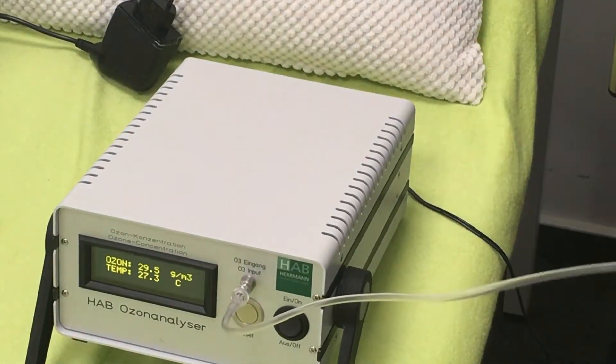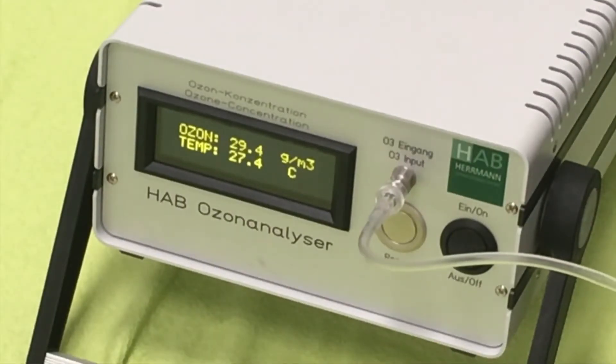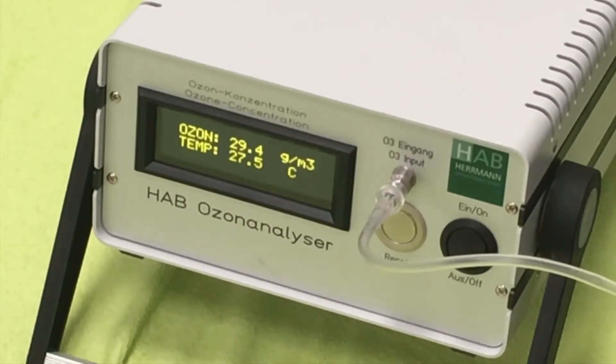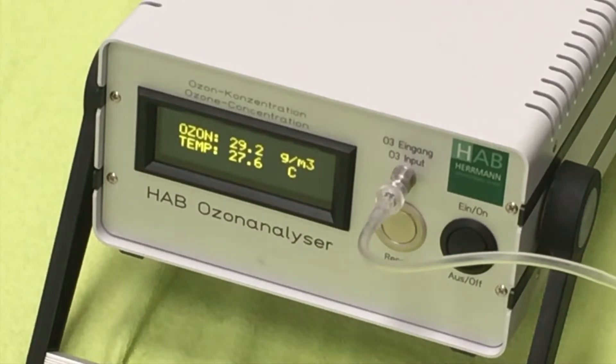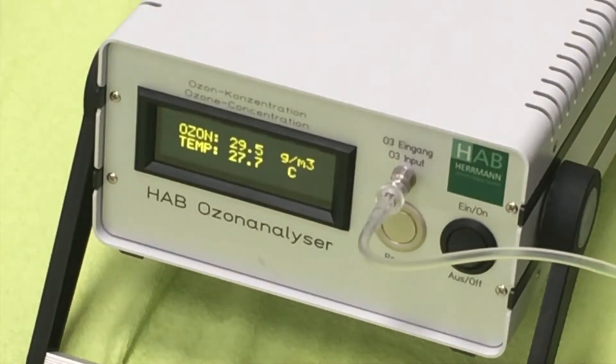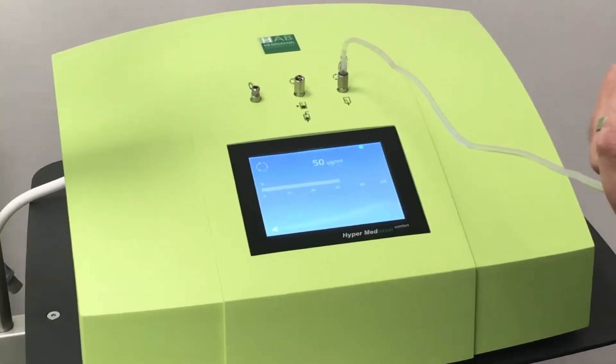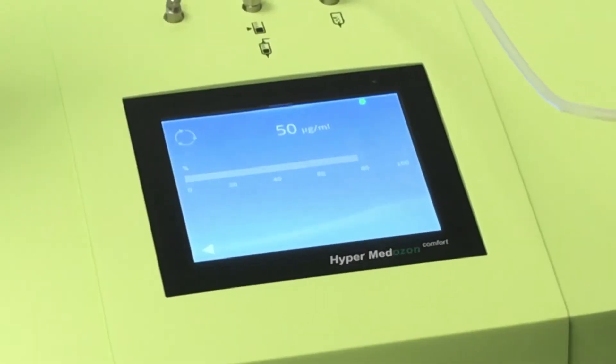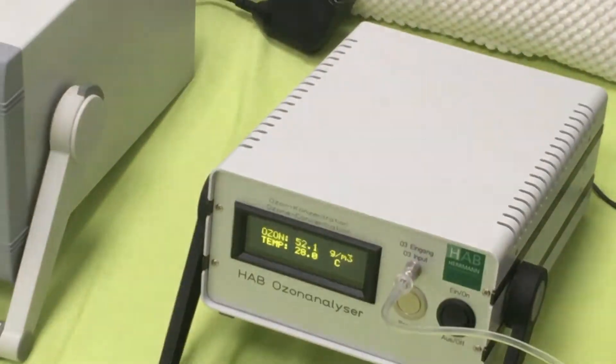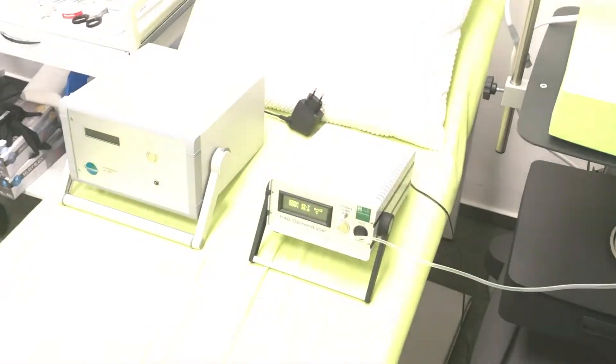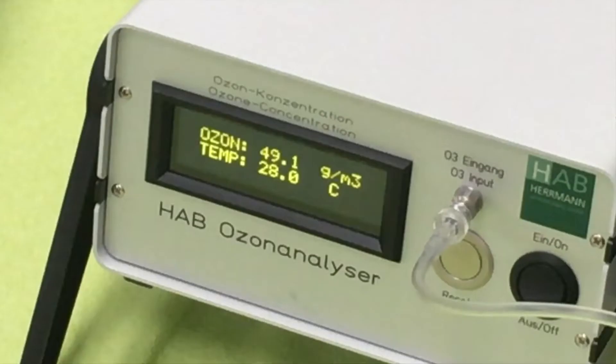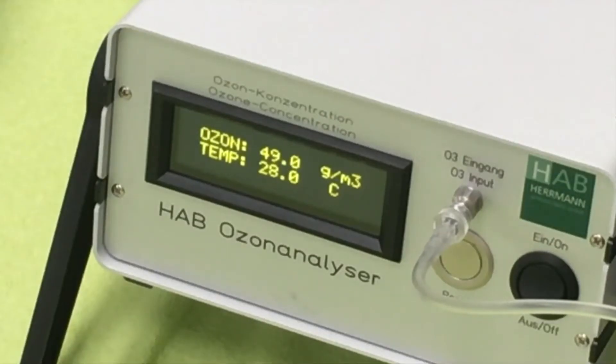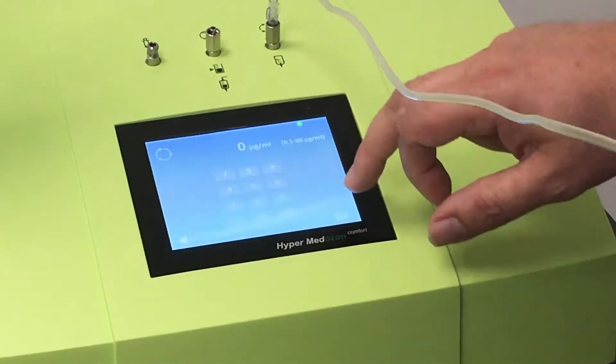We chose 30 micrograms per milliliter and the machine showed 29.3. At 50 micrograms per milliliter, the result was 49.2, 49, 49.1, also within the promised range.